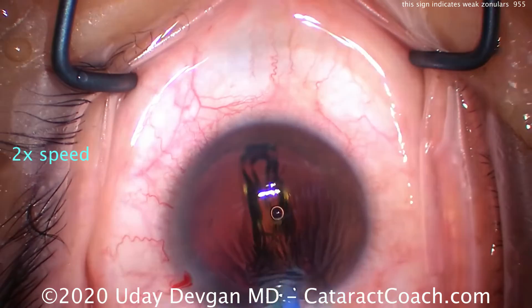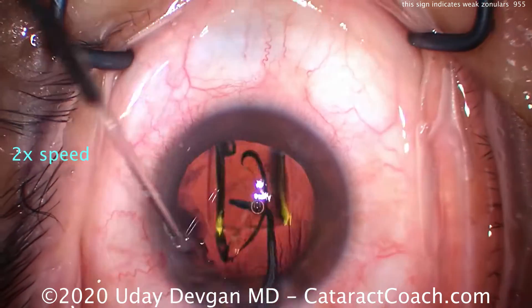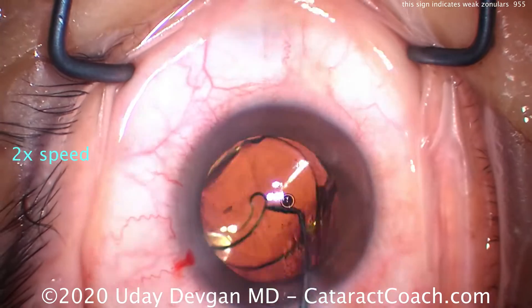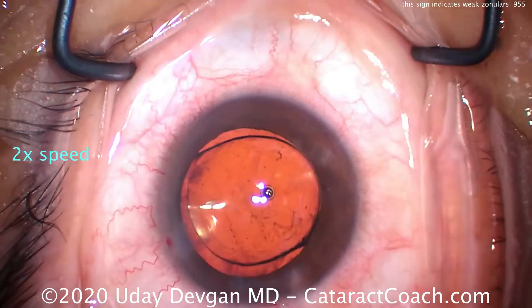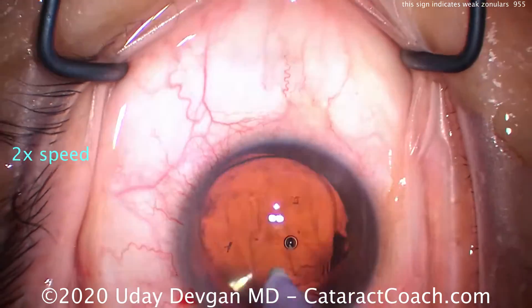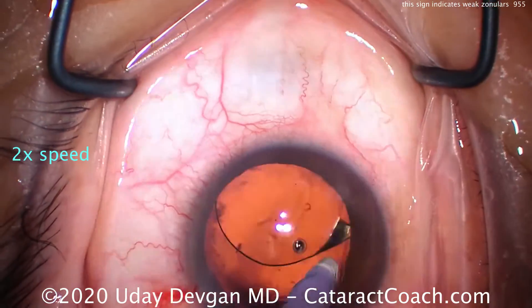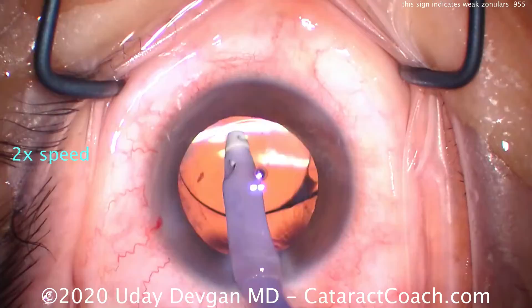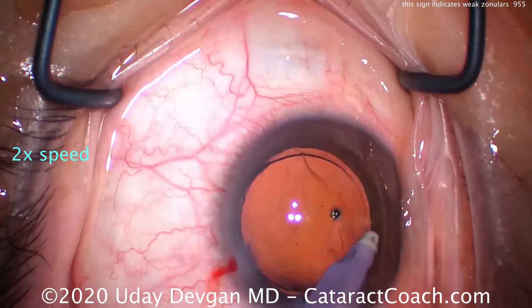Filling up our bag — let's put the lens in. Here comes the IOL — that looks great. We're going to place a single-piece acrylic lens in the bag, and I think the patient will have a normal outcome. Note there was no phacodonesis to begin with, and I think we're not going to have any pseudo-phacodonesis either. Tenting up that iris to equilibrate the pressure in the anterior and posterior chamber, and now let's take out all the viscoelastic. The case proceeds pretty normally at this point.